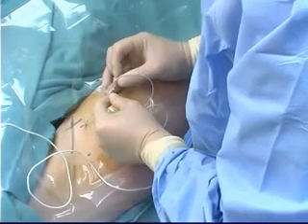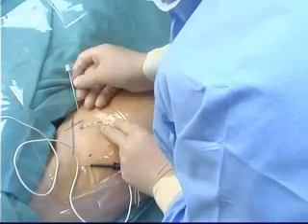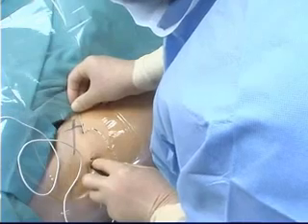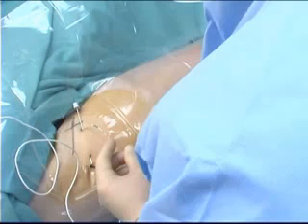Remove the needle without disturbing the catheter. The catheter is tunneled by first inserting the inner stylet of the needle 1 to 2 millimeters from the catheter exit site if a skin bridge is required, and advancing it subcutaneously to a point approximately 8 to 10 centimeters laterally if this is appropriate for the surgery.